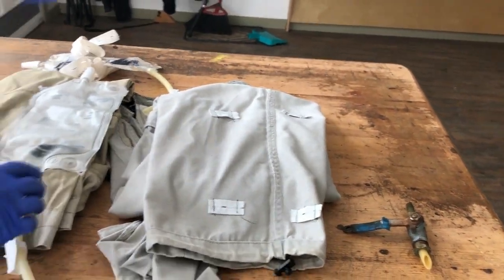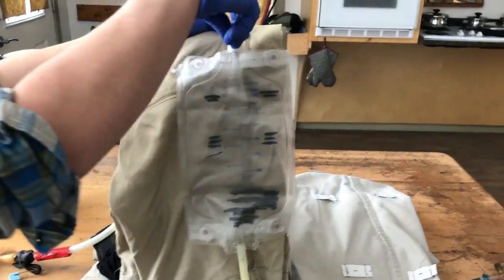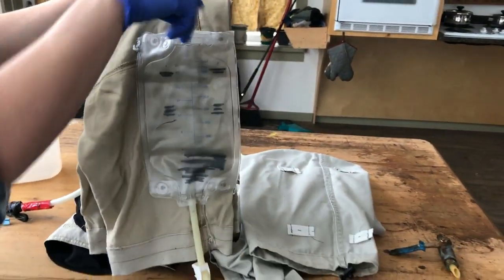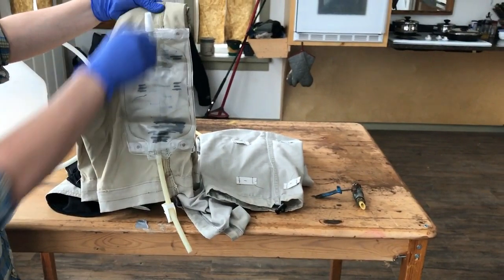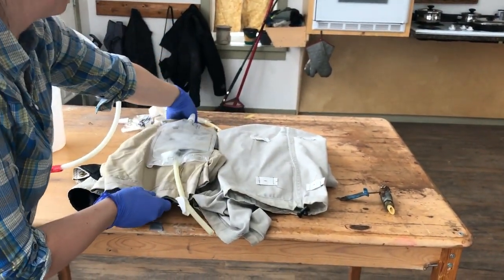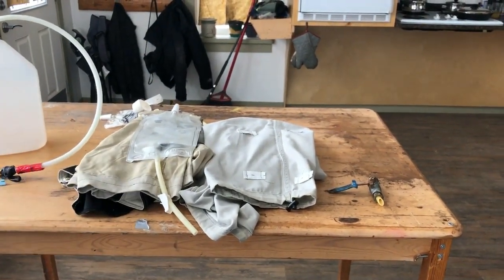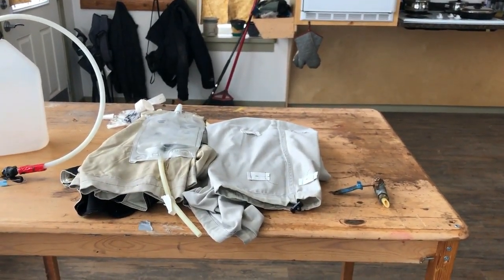So once your leg bag's attached, it's nice and secured, and you can bounce around all day and it should stay there, and it won't crimp the hose down, so you'll be able to empty it all day. And added benefit, you won't have a couple tourniquets around your calf, cutting your circulation off.